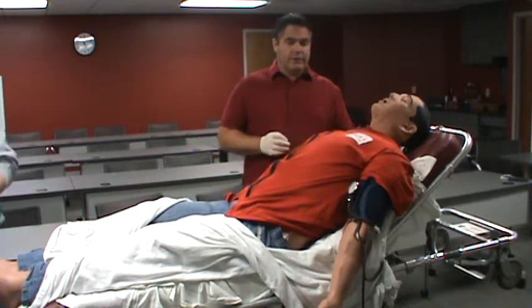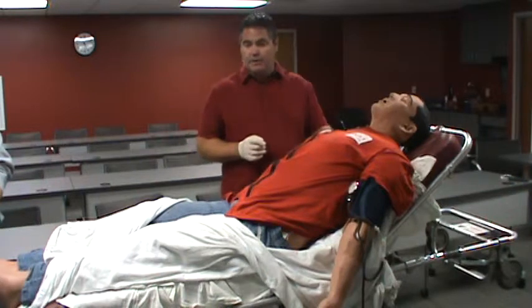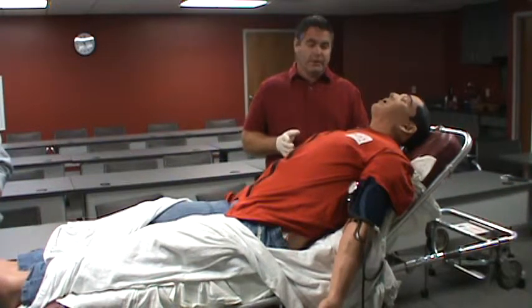Looking at the simulator, this is a CAE pre-hospital mediman. From head to toe, we're going to go through some functions. First of all, he does have the ability to talk — we'll be in a control room talking for him, or we can make sounds for him as well, including some pre-recorded sounds.